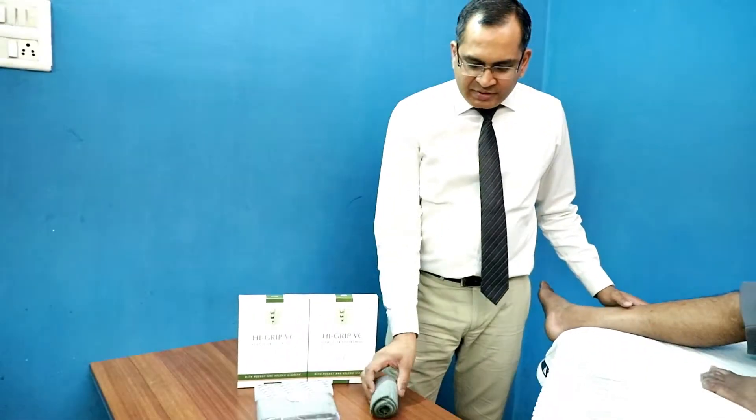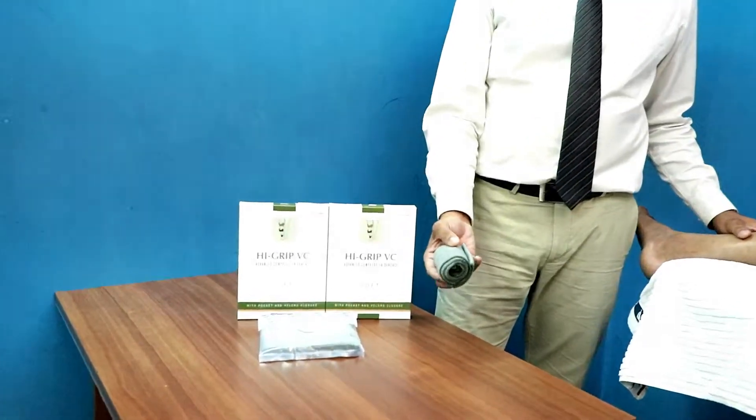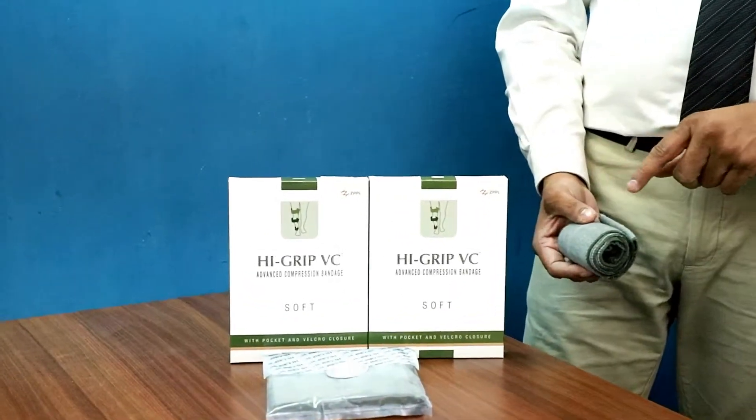Hi, I am Dr. Anurag Chitranji. I am a plastic surgeon. I will be showing you today how to apply a compression bandage. These are the two advanced compression bandages which I am going to use today — one is a 4 inch one and one is a 6 inch one.